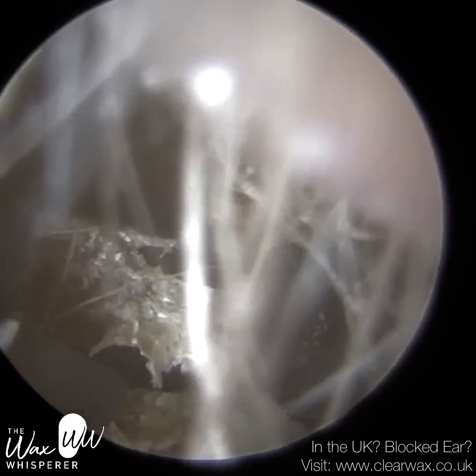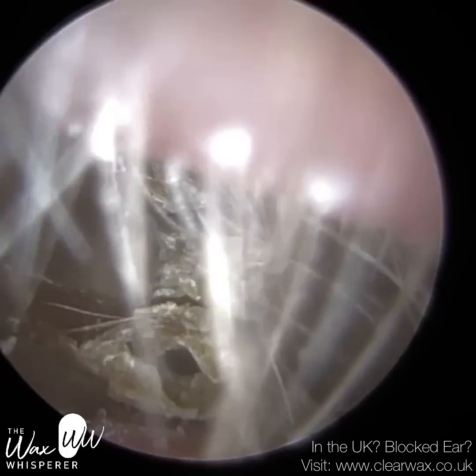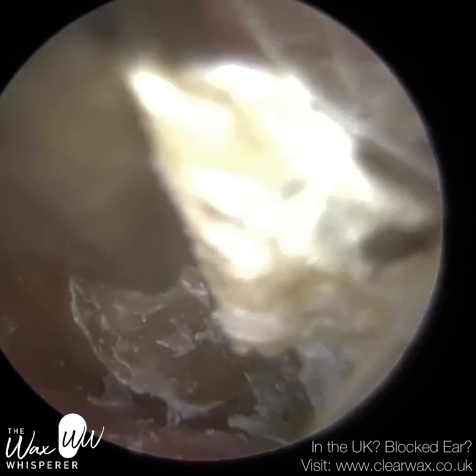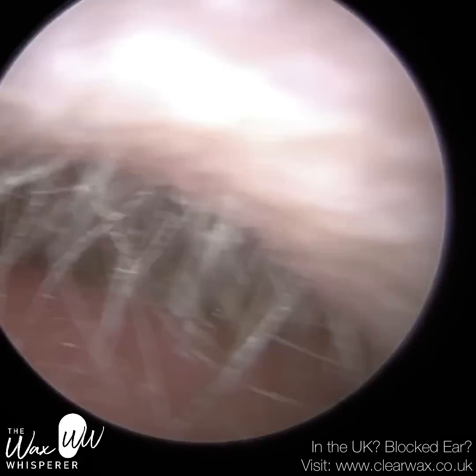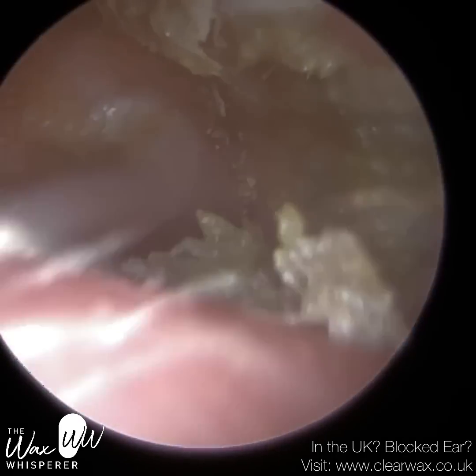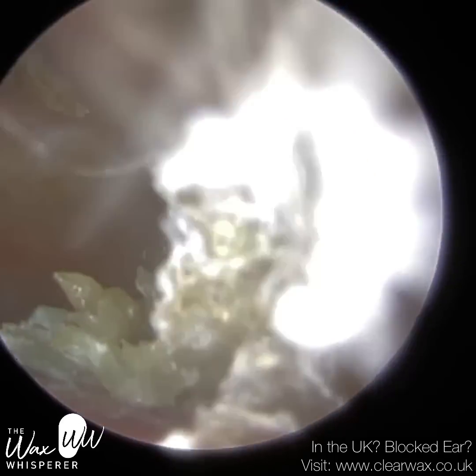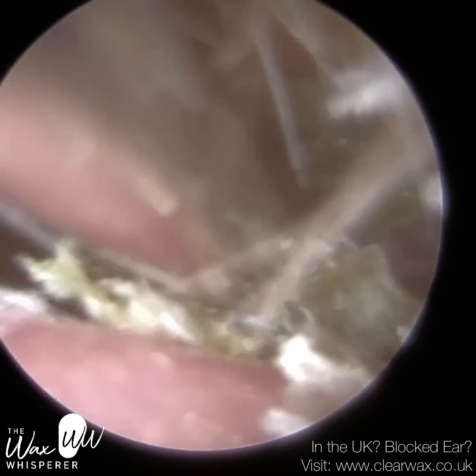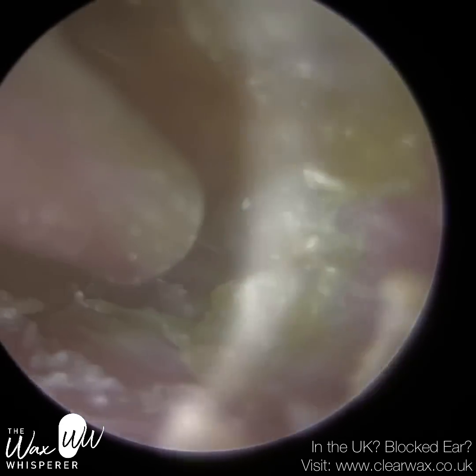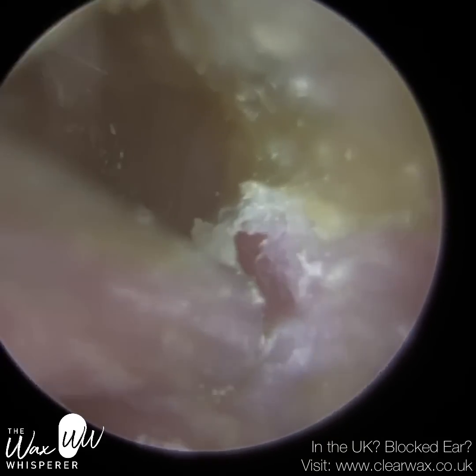By virtue of the fact that water caused this infection, we don't want to introduce any water if possible. I am going to use some olive oil drops, which are obviously free from water — it's 100% medical grade olive oil. In the end I did have to use some sodium bicarbonate drops, which are water-based. We ensured we dried the ear as much as possible afterwards, and I've asked the patient to obtain some acetic acid spray for the ear over the counter, which will help further dry the ear and expel water.